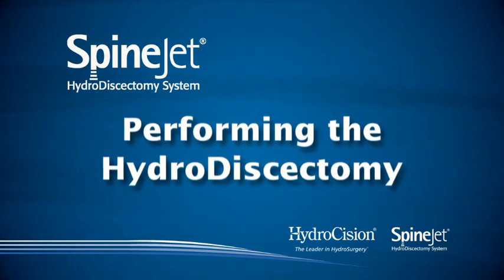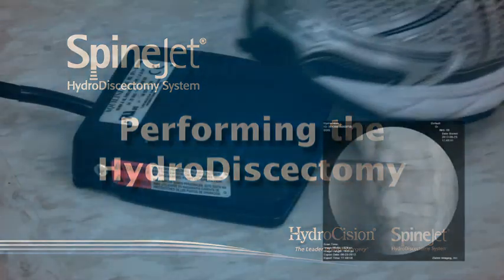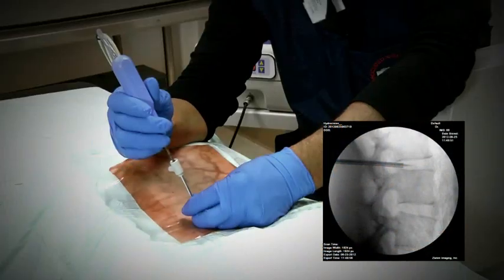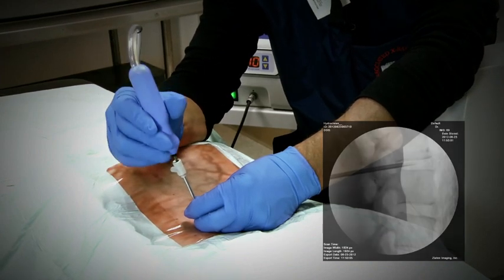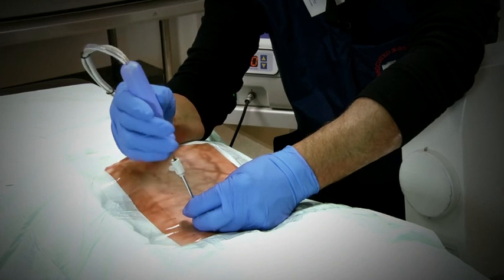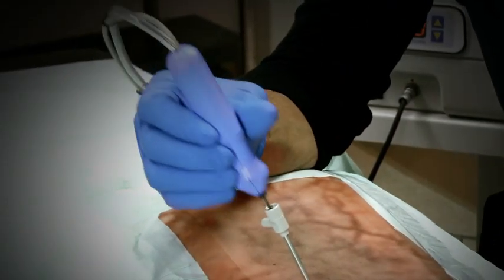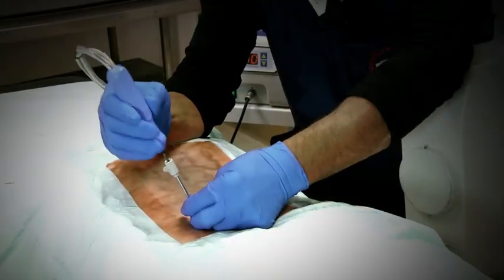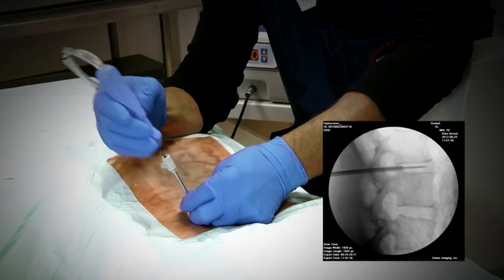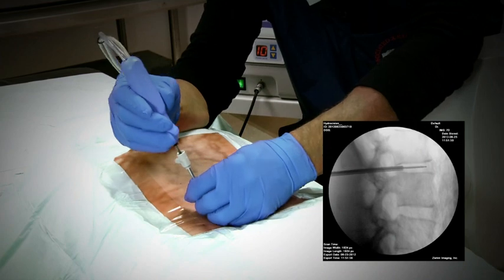The entire procedure is typically accomplished in approximately three minutes. We begin by moving the PERC resector's distal tip in and out of the cannula for 10 seconds to create space within the nucleus. While doing this, be careful not to advance it more than one-half a centimeter beyond the end of the cannula. Begin moving the PERC resector using a piston motion, slowly advancing as material is cleared.